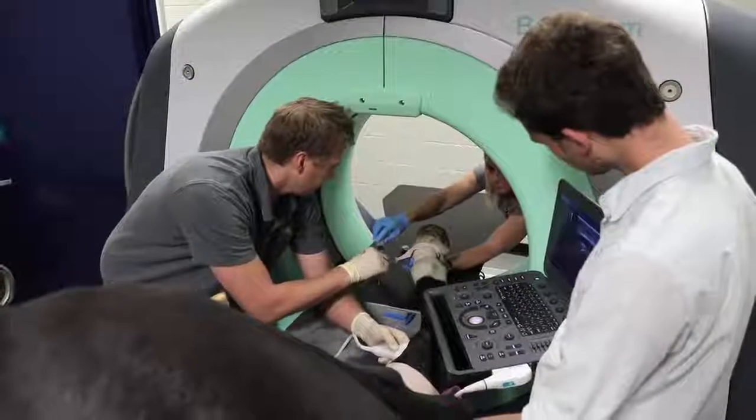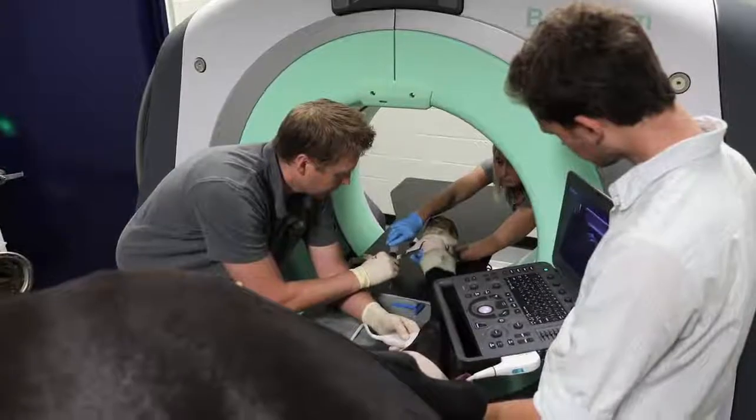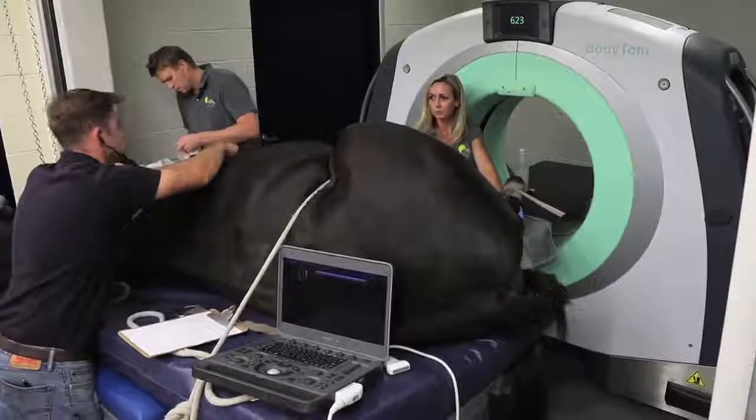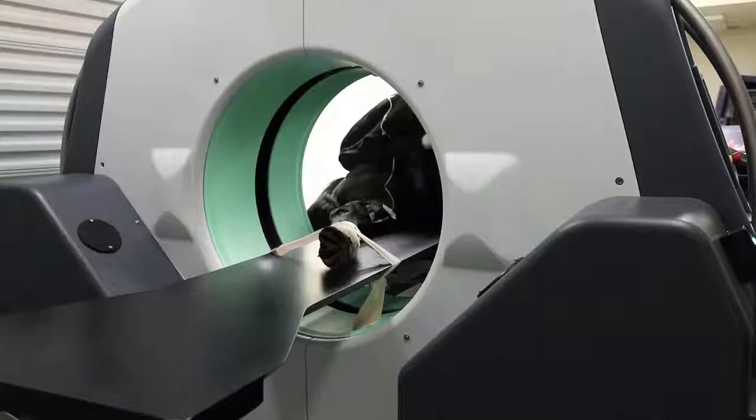With our distal extremity cases, we like to use arterial contrast to enhance the soft tissue imaging. It really accentuates the lesions for us, especially the acute lesions. But we've been really pleased with the quality of imaging to both the soft tissue structures and the bone surfaces. One of our favorite uses of the CT in our sports medicine practice is the proximal suspensory.